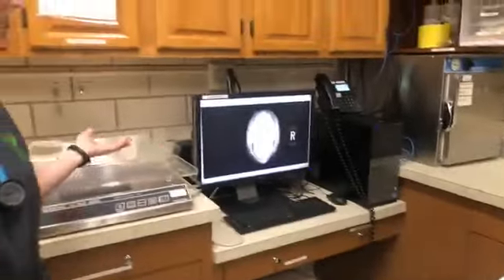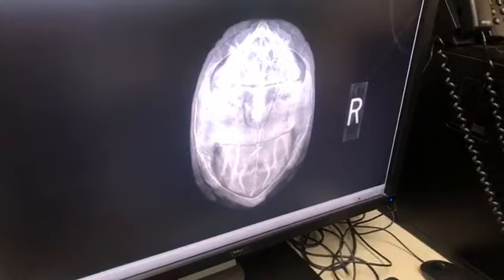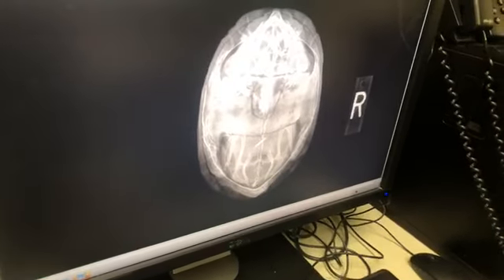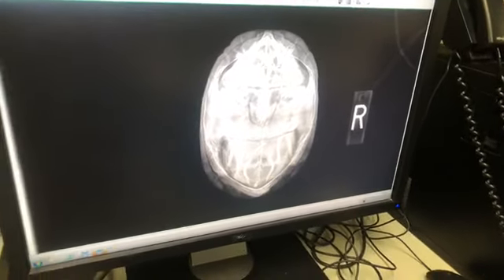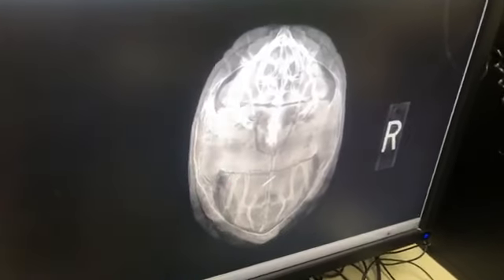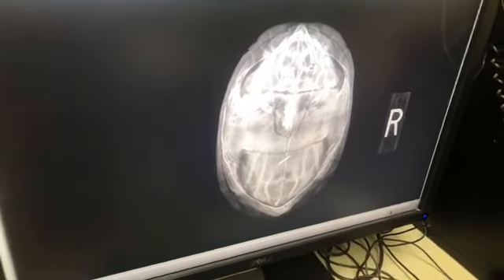And I just have another x-ray pulled up. This is pretty cool. So this is one of our mud turtles, and you saw a video on them previously from the Conservation Center. And so I'm just going to show you an x-ray. So it's a really cool turtle, and you can see his head is tucked in and all his arms and legs are tucked in. So we were basically just doing a scan of how they were doing since they went through what they went through.